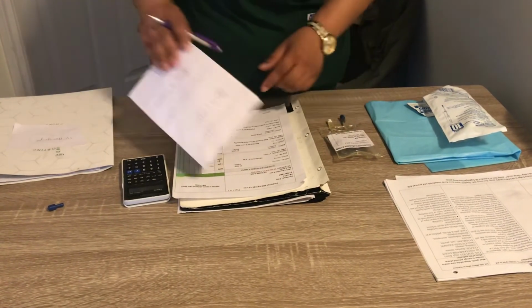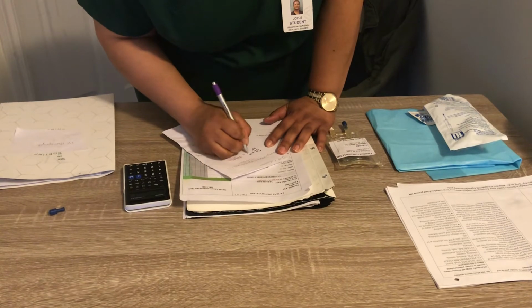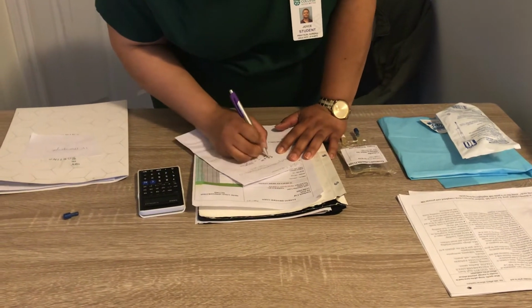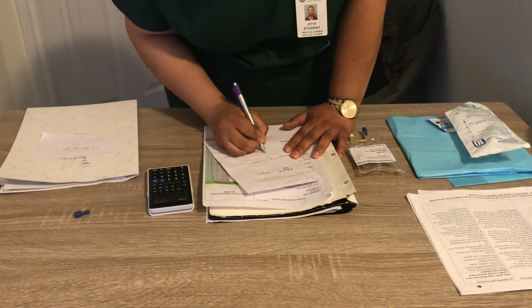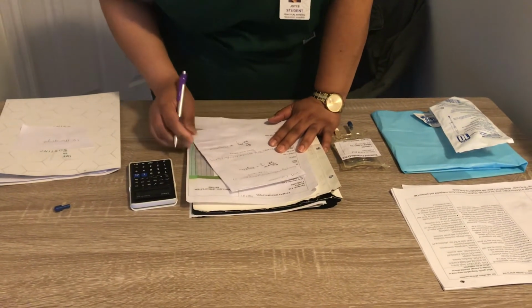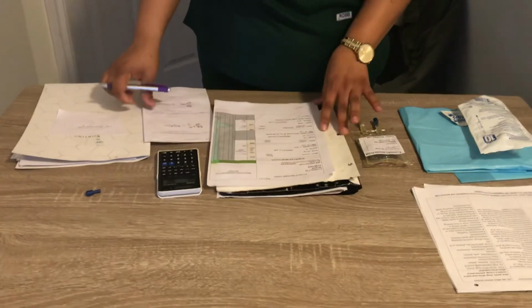So I'm going to flip my worksheet over again and do my second calculation. First of all, by gravity. And that's giving me 20 GTT per minute. And the next calculation is by pump. And that's 120 mil per hour. So at this point, I'm going to call my tester over to come review my calculations. And once that's done, we're going to start to prepare the med.